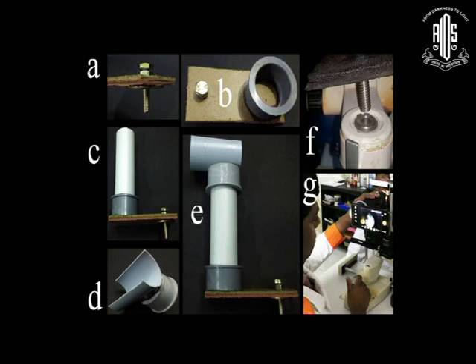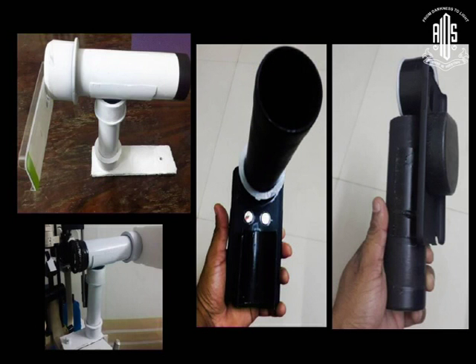You can also make a slit lamp mount, just like the way I said, with common materials. The slit lamp mount, which you would have seen in the stalls, can be mounted onto the slot for the focusing rod on the slit lamp, and then you can focus the whole thing or align the system just like you would do in a conventional fundus camera using the joystick. With some color, paint and some creativity unleashed, you can make it look like a professional device.